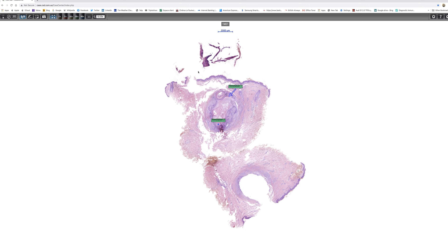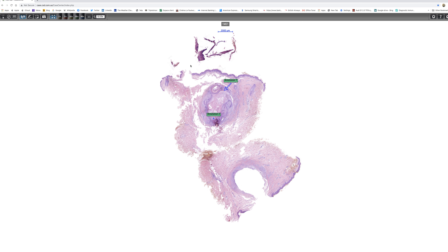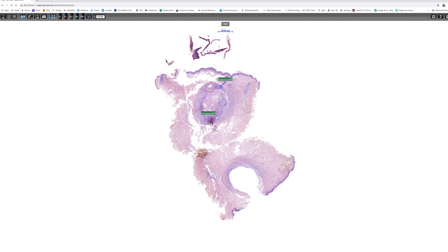to show you an unusual variant of cutaneous cyst. At this scanning magnification, you can see a cystic cavity containing keratinous debris in the dermis.